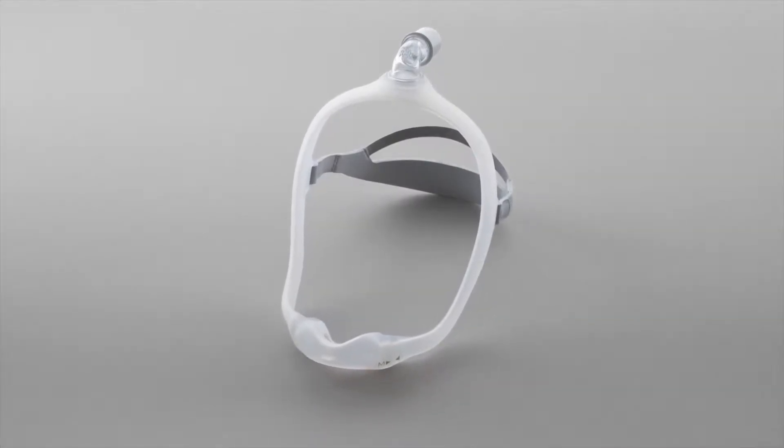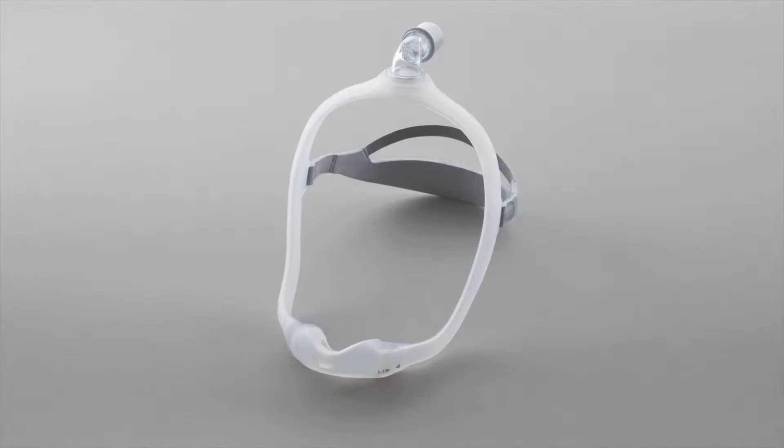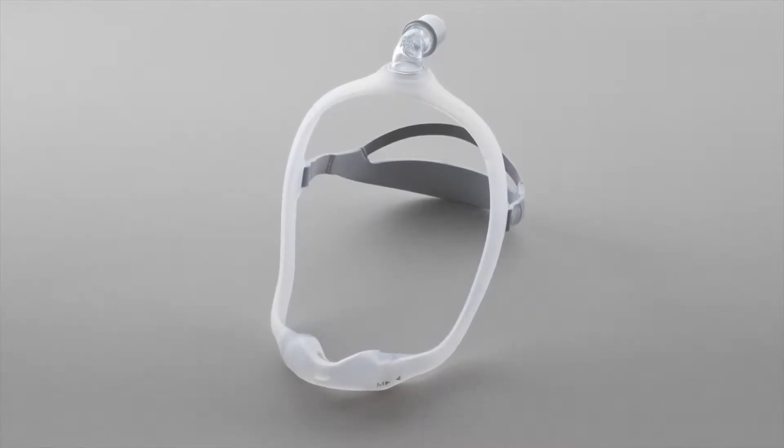Welcome. This helpful video will walk you through the proper fitting for your Philips Respironics Dreamwear Under the Nose Nasal Mask.